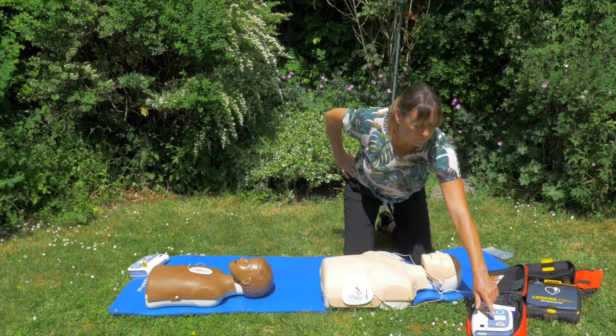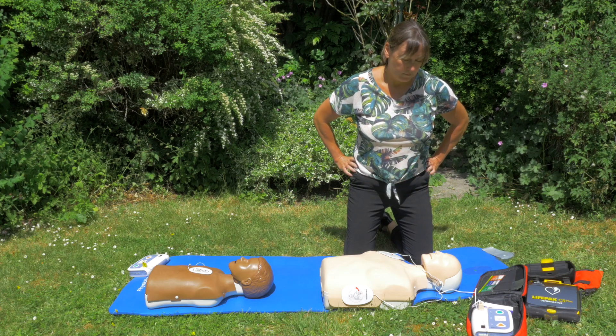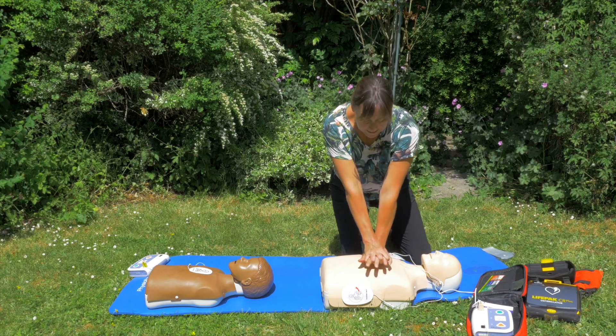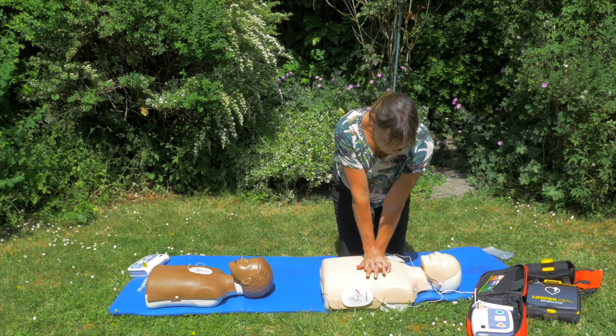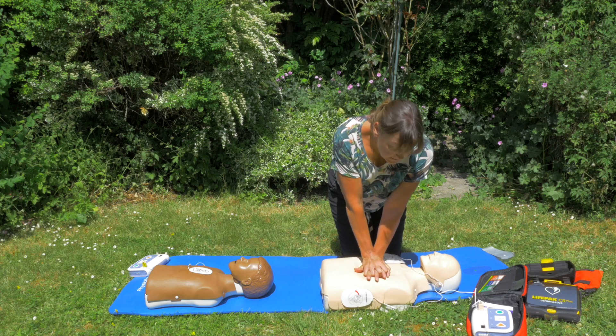The device says 'Deliver shock now — press the orange button.' Now. 'Shock delivered.' Then 'Begin CPR.' So that hasn't worked, so we come into the centre of the chest and begin compressions, trying to keep in time with the beeping.